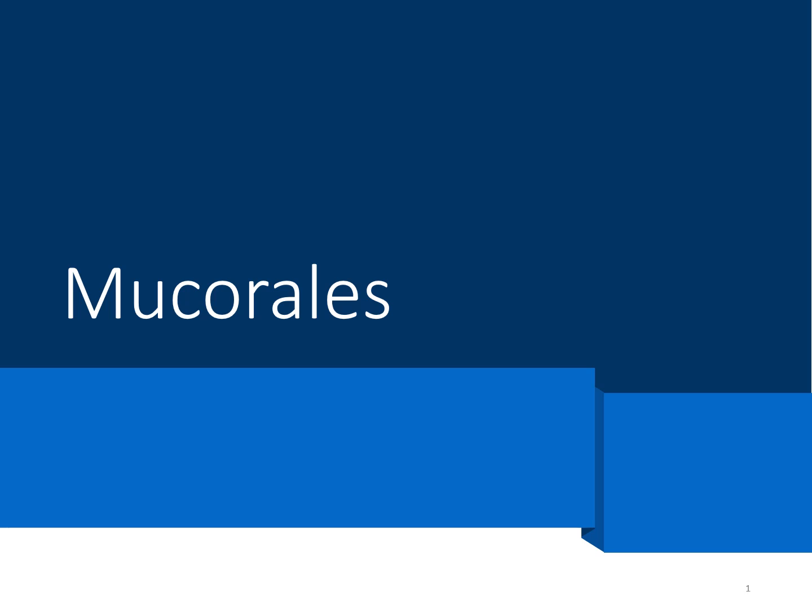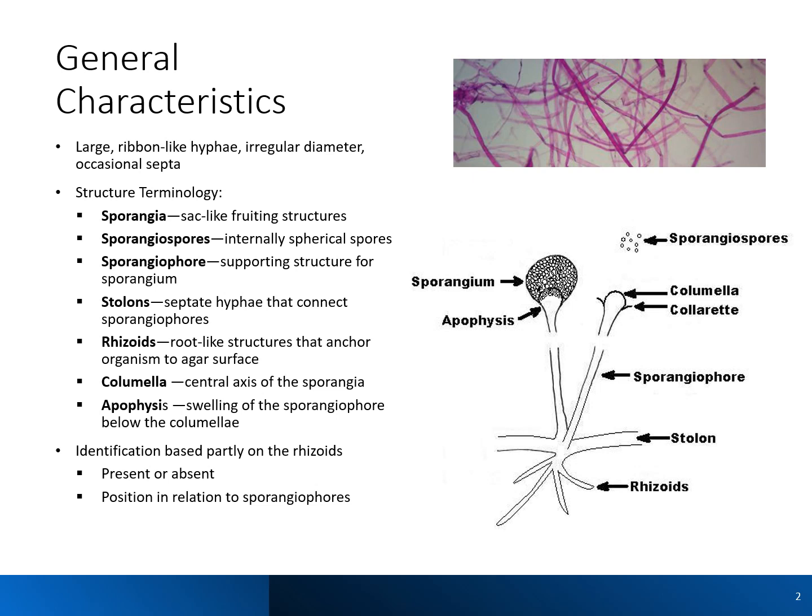This PowerPoint will cover the Mucorales. With the Mucorales, we will identify them microscopically based on several of these characteristics, so you should go ahead and be familiar with this terminology. To start off with, their hyphae are very ribbon-like.